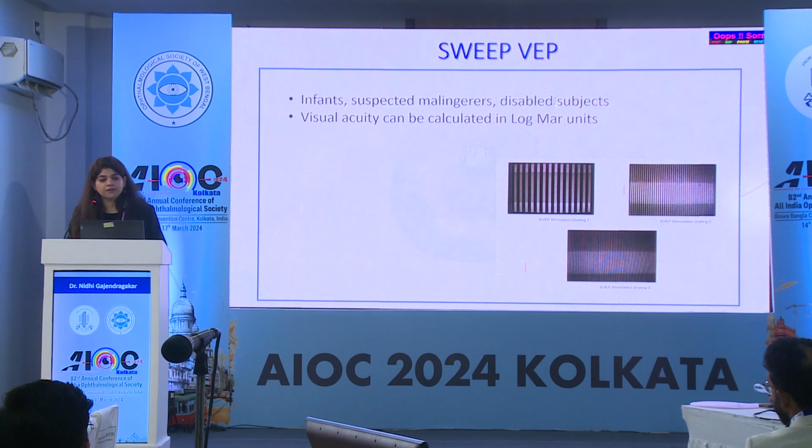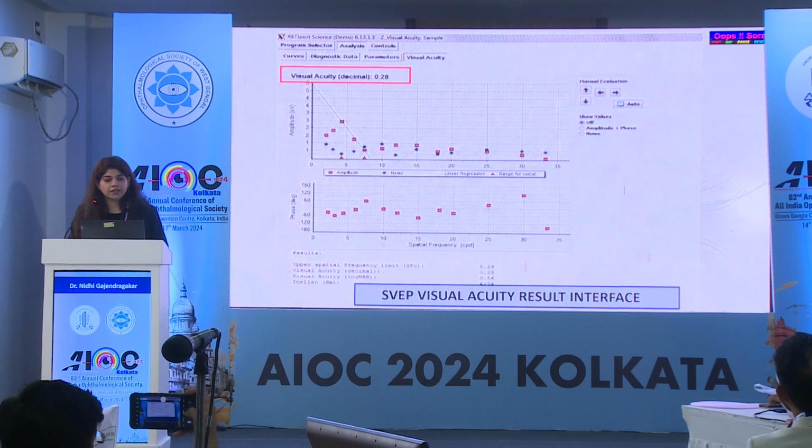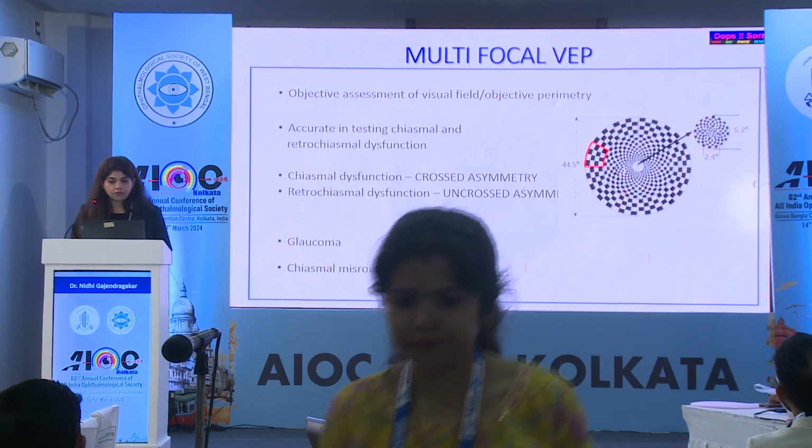Just a note on sweep VEP: it is done for infants, suspected malingerers or disabled subjects. Here the visual acuity is actually extrapolated and calculated in logMAR units. So this is how the result interface will look, and everything is extrapolated here through an algorithm.